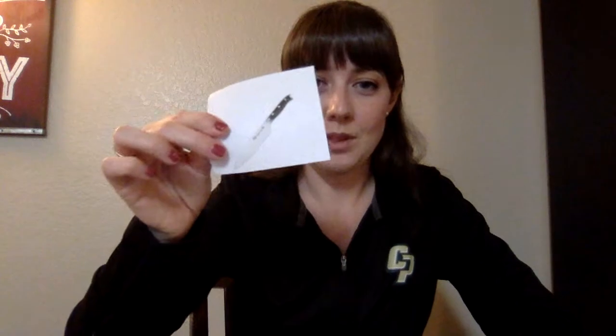And then in order to determine if your patient's ability to name has improved, you would do the naming task that we did at baseline, which is, what is this? What is this? Without being connected to the currents or to the TDCS treatment. And you would use a data tracking sheet as to if they are naming it correctly. And again, you can transcribe while it's happening, or you can choose to audio record it and transcribe it later, so long as that you're transcribing in the correct order of what word is presented.